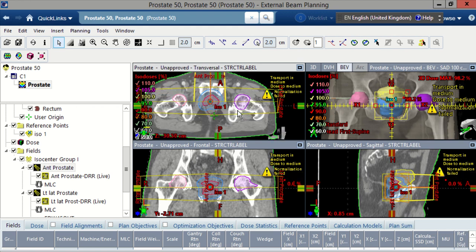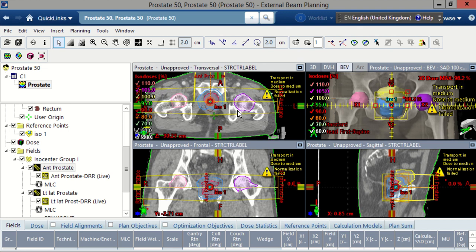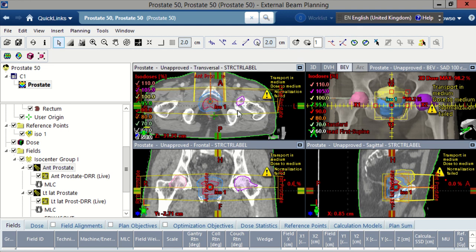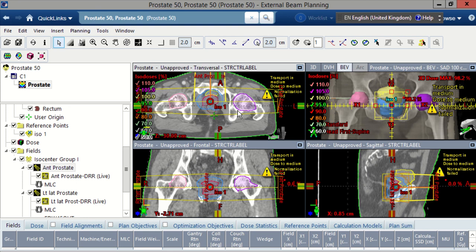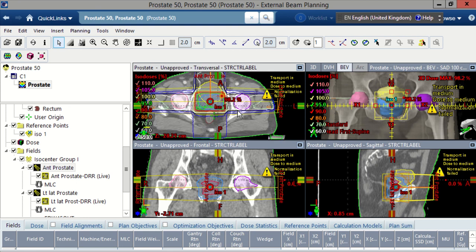Once we're happy with the beams and they're in place where we want them to be, we then apply some dose through the plan, and that allows us to see exactly what's happening within the body of the patient. The idea being that we are knowing what we're treating and what we're avoiding, making sure that the target we want to give lots of dose to is getting lots of dose, where everything else is minimized.